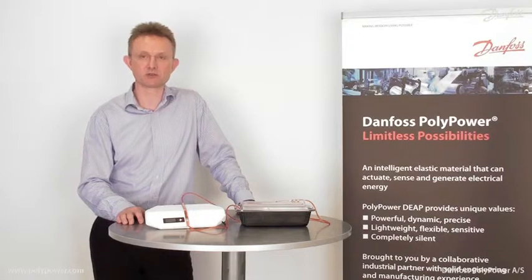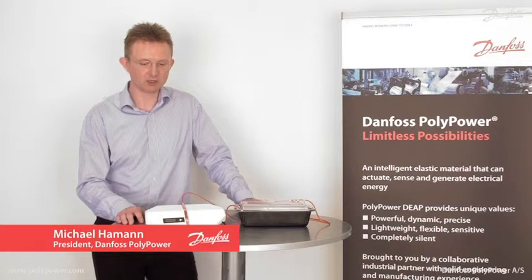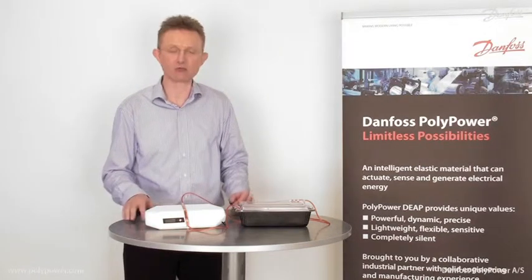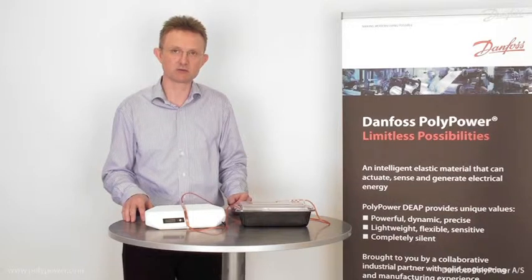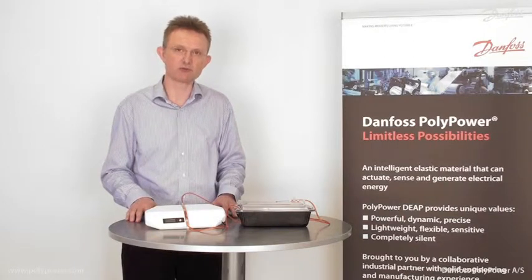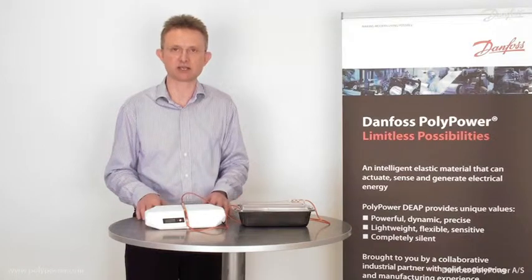Dosing and mineral pumps is a very interesting area for the polypower technology. This infusion pump is very smooth and accurate in operation. It features a proportionally controlled flow from 0 to 200 milliliters per minute and is completely silent in operation.